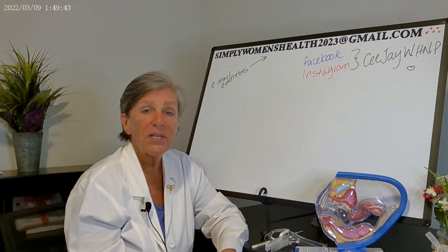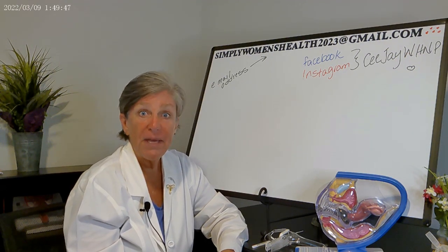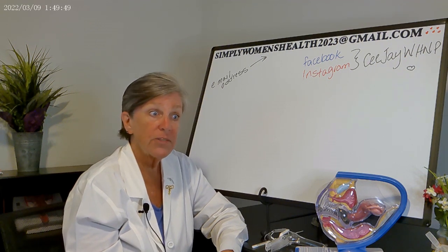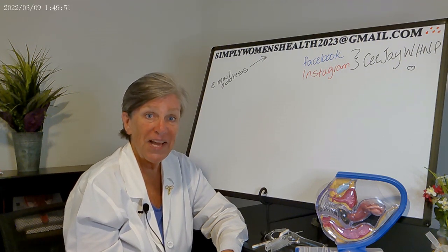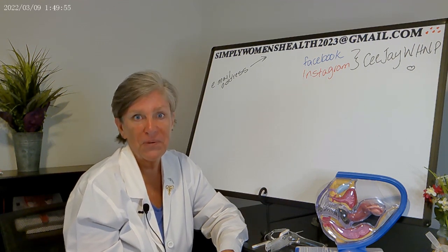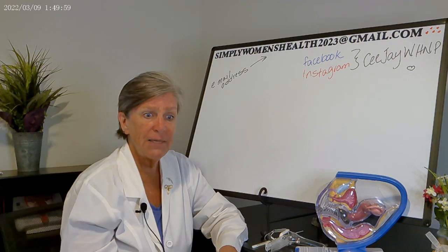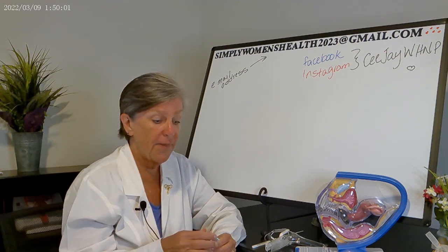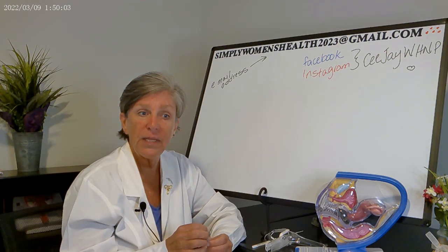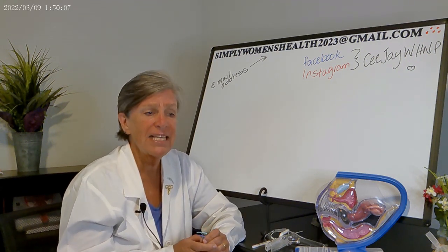Hello. Today we're going to talk about the intrauterine device, or the IUD. There's two basic IUDs on the market. There's IUDs that contain hormones, and there's IUDs that don't contain any hormones. Today we're going to focus on the hormonal IUD. There's a number of different products on the market. Today we're going to focus mostly on the Kyleena as well as the Mirena, only because those are the products that I use in my practice.